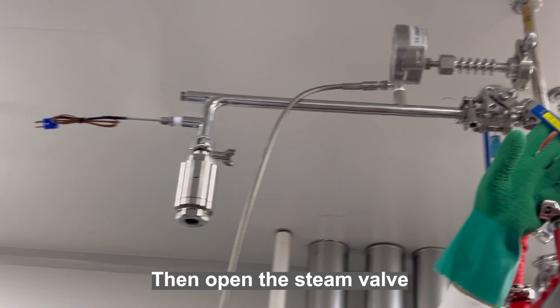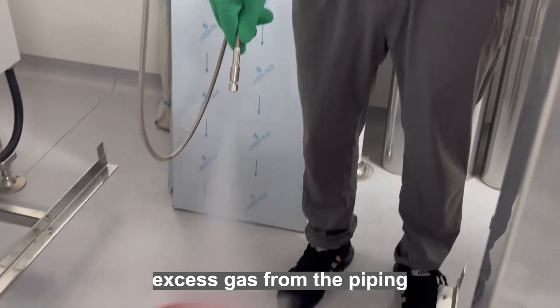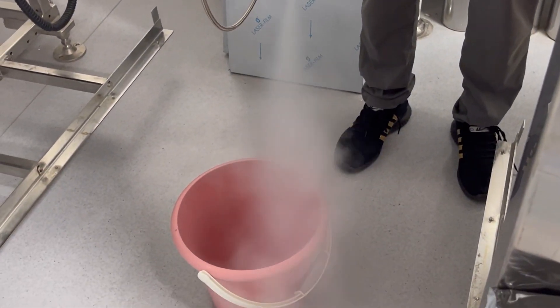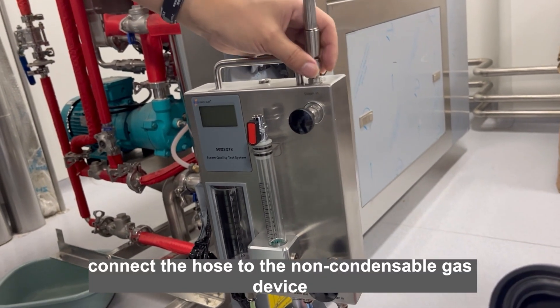Then open the steam valve to discharge the condensate and excess gas from the piping. After discharging, connect the hose to the non-condensable gas device.